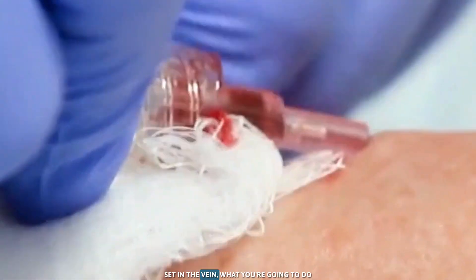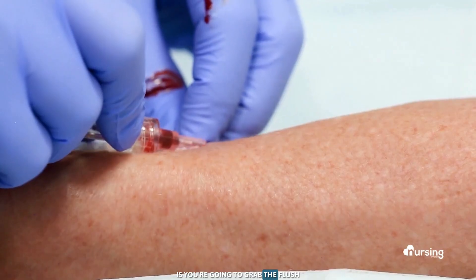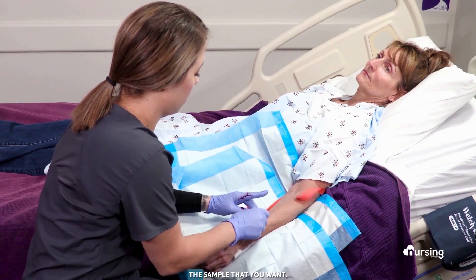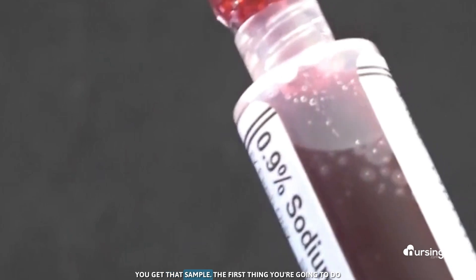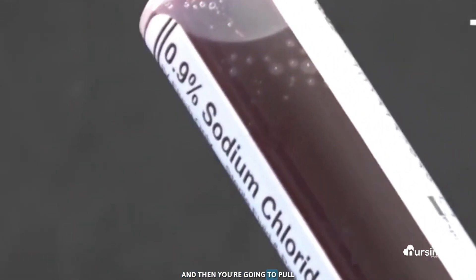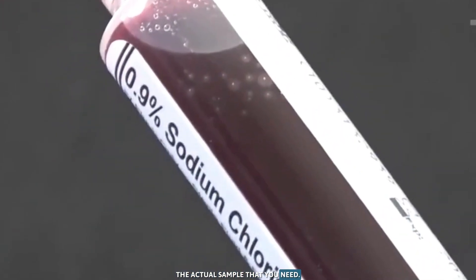Once you get your IV set in the vein, grab the flush and withdraw the sample that you need. Once you get that sample, the first thing you're going to do is waste three to five mils, and then you're going to pull the actual sample that you need.